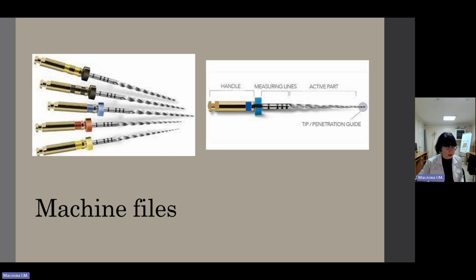The core diameter is inversely related to the flute depth. The proportion of the core diameter to the outside diameter should be greatest at the tip, where strength is more important. By uniformly decreasing the proportion, the flute depth moves up the taper, resulting in greater flute depth. The flexibility increases while the strength of the instrument is maintained. An additional advantage is that the debris is also removed more efficiently.